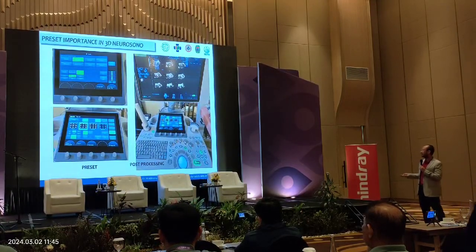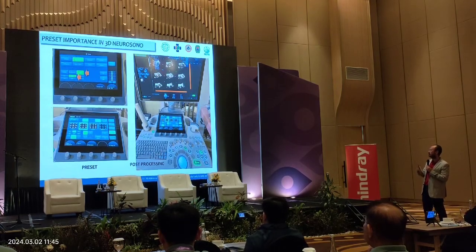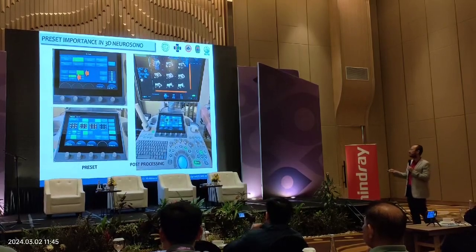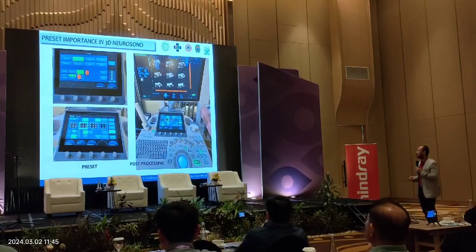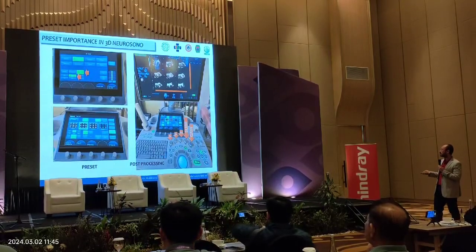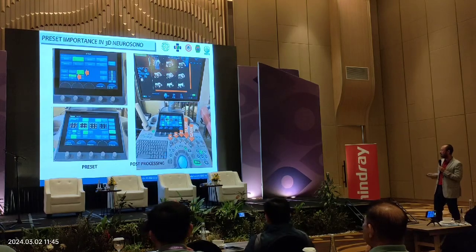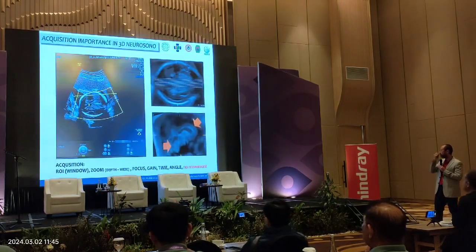So in post-processing here, if you choose 3x3, we can only see 9 pictures. If we want to see more pictures, we choose different numbers for them. This is the XYZ for rotating and sliding. We also need to increase the gain so that we can measure.